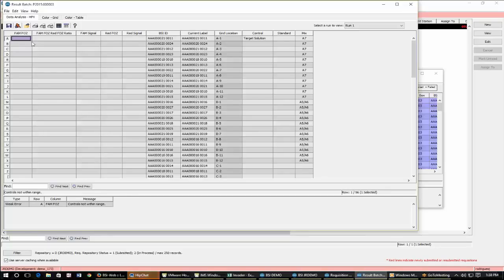So hopefully, once we add data, that will be an acceptable value. And so this is our table that we set up with the Invader Analysis HPV, where we have each row representing one vial, and then each column is a different piece of information.